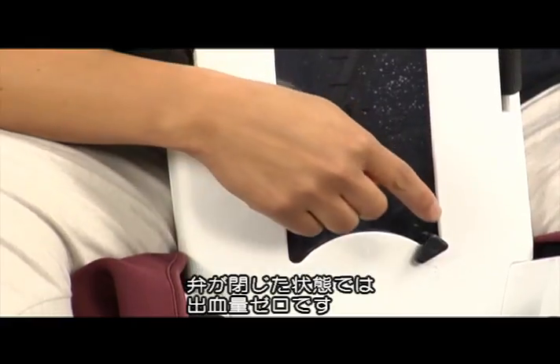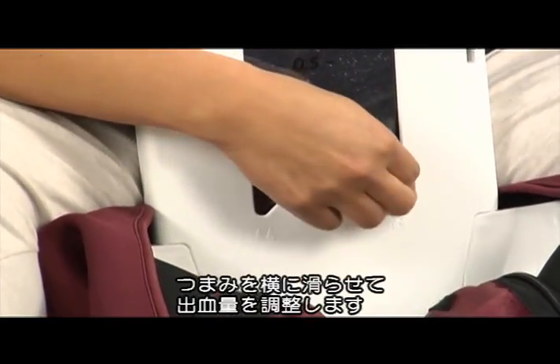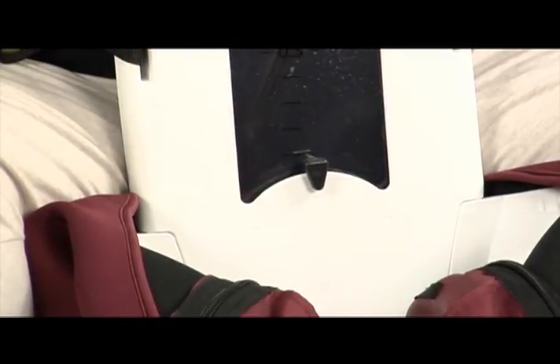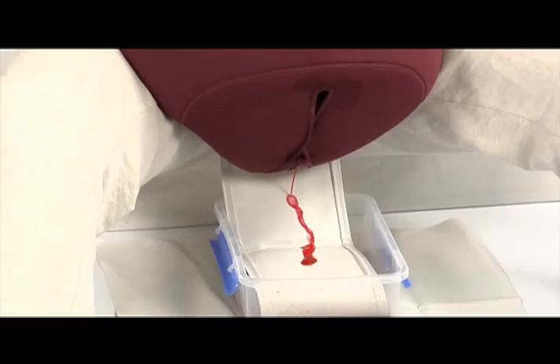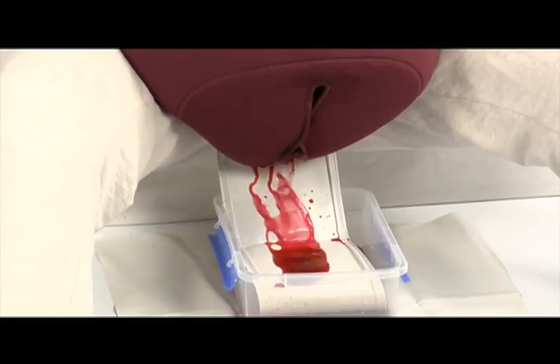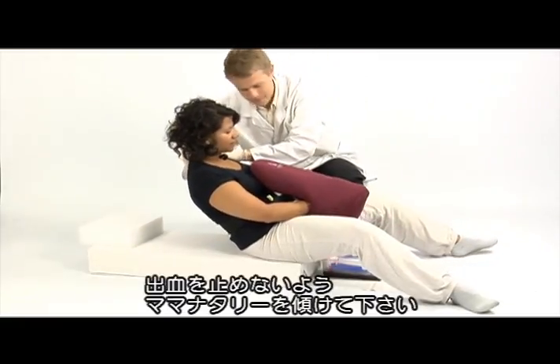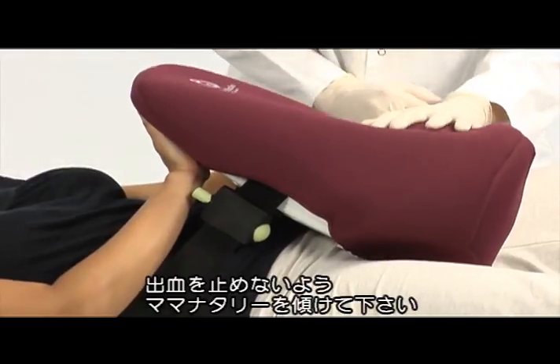Start with the blood slider in a closed position — no bleeding. Push the blood valve inwards and slide it sideways to regulate the blood flow. Place the handle halfway for normal bleeding and full for excessive bleeding. If the operator lies flat, tilt Mama Natalie forward to keep the blood running.